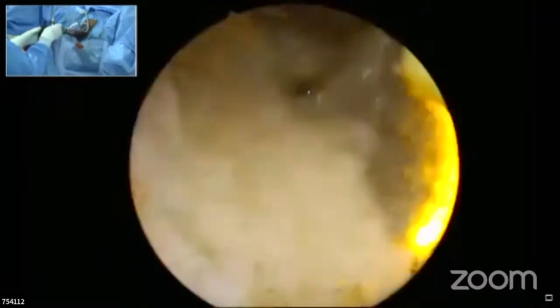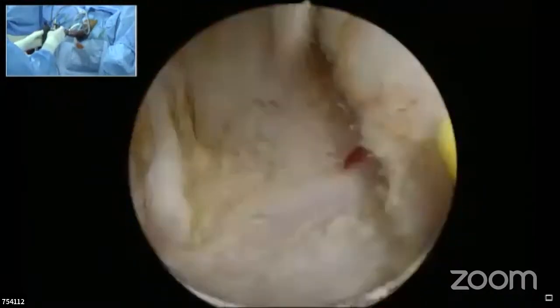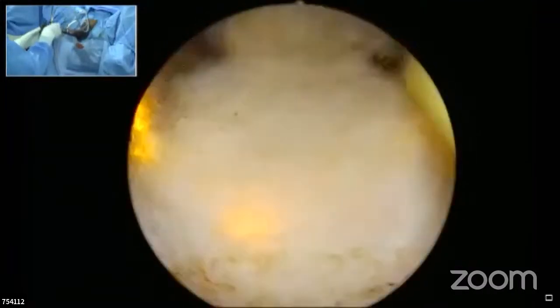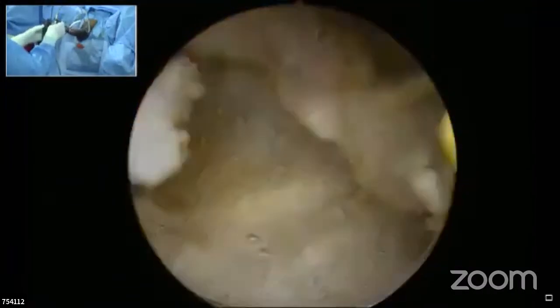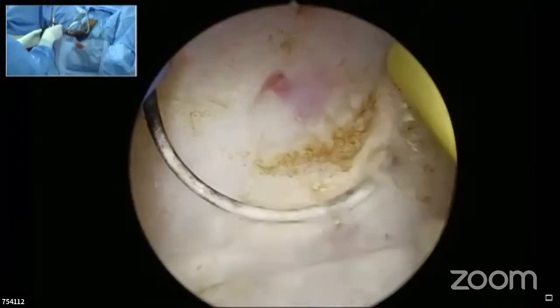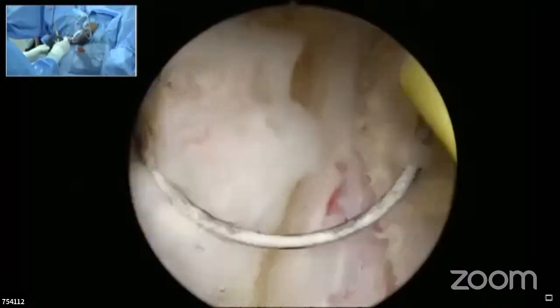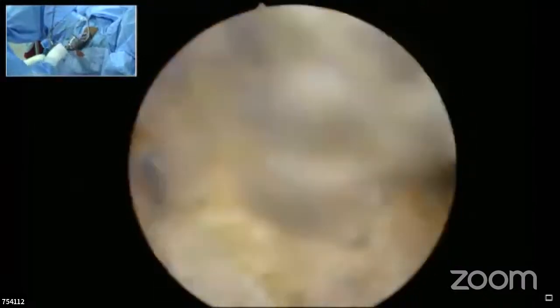We need to understand that it is not the mechanical cut or the force of the loop which cuts the tissue. It is the corona which cuts the tissue. So your movement in the tissue, or the cut of the tissue, is not dependent on the loop or mechanics. It's basically by the corona. So you need to get some adaptability. Sometimes it will take time to adapt.